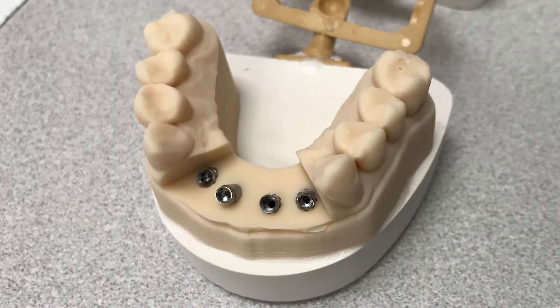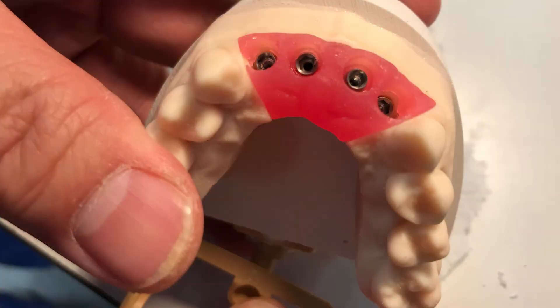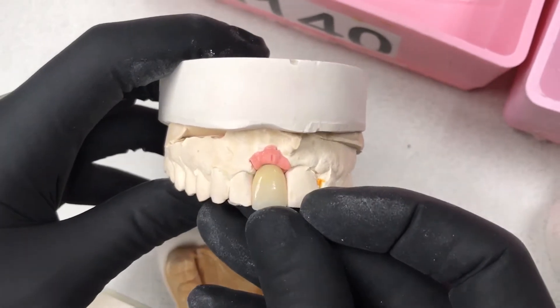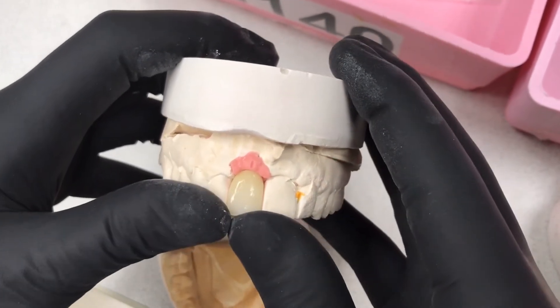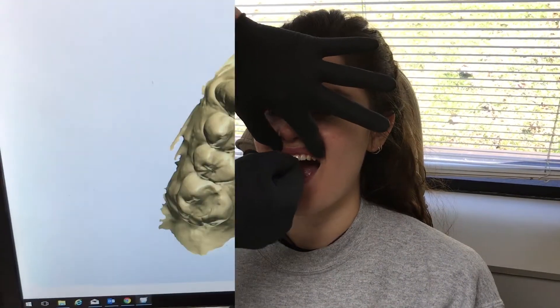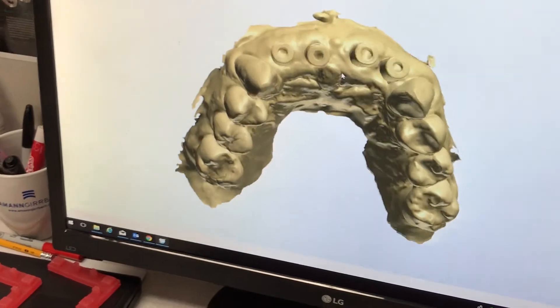Today we're going to show you how to make 3D printed pink tissue for a 4-implant case on a 3D printed model. The purpose of this is to better mimic real tissue in a patient's mouth so the dental technician can make prosthetics that fit well in the patient's mouth. The first thing you need is the STL file of the scan body of the patient's mouth.